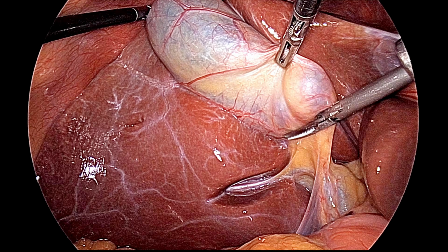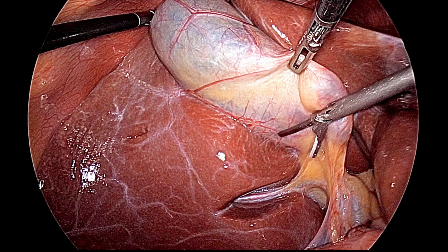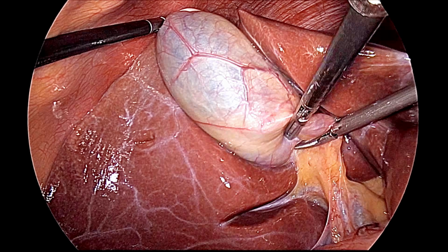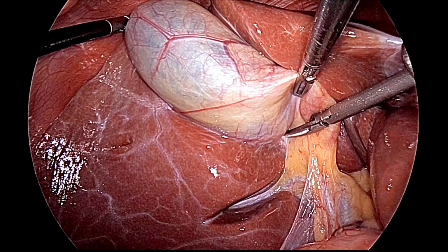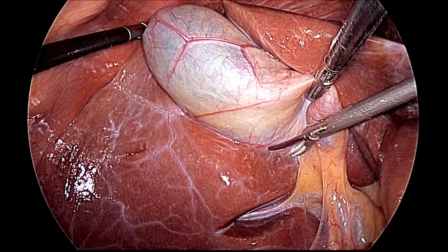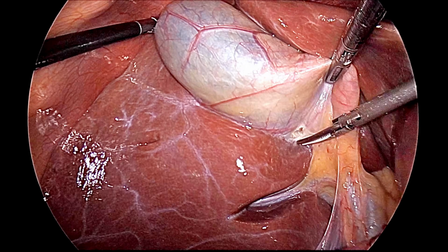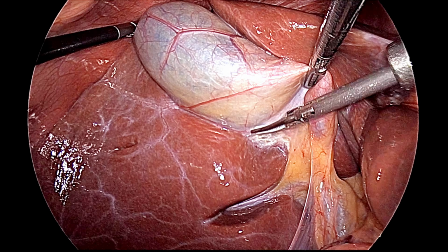So, the posterior peritoneal dissection is started. We should only cut the peritoneum, and we should try to avoid keeping the vibrating jaw towards the gallbladder, otherwise it will puncture. Slowly, at least one third of the posterior peritoneum of the gallbladder should be separated.